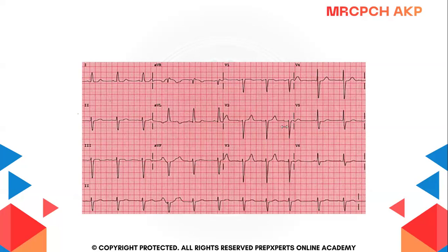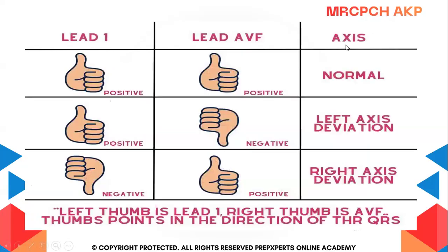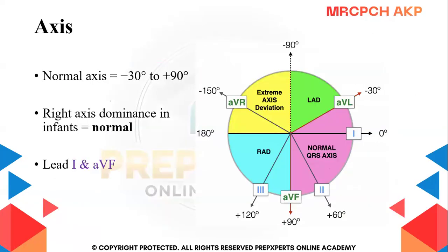I'm glad that people are replying. Can you show again the pic of angle? Okay, so you want to see basically the pie chart that was telling you about the axis, right? So everybody's answering left axis. Okay, first we'll show Dr. Shanze about the slide. This one, are you talking about Dr. Shanze?